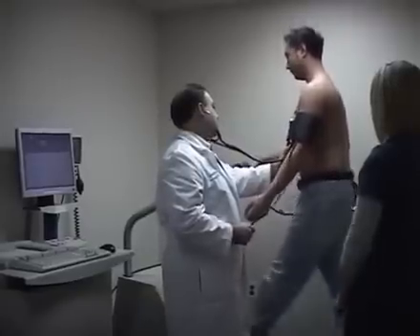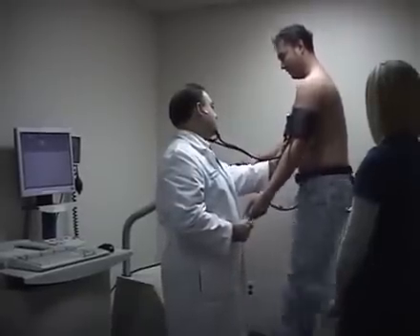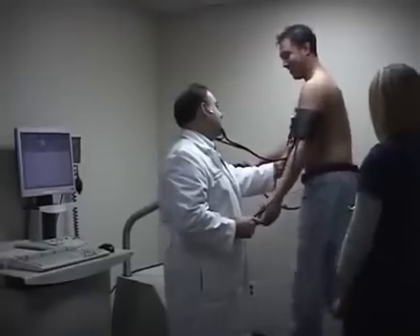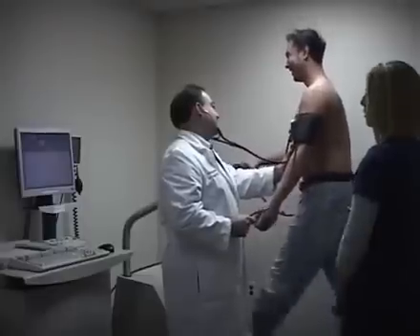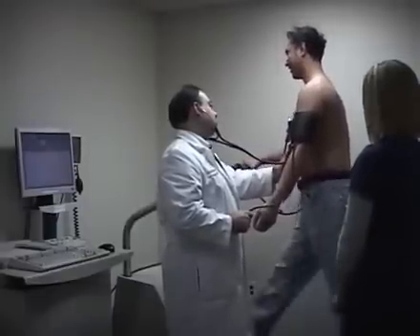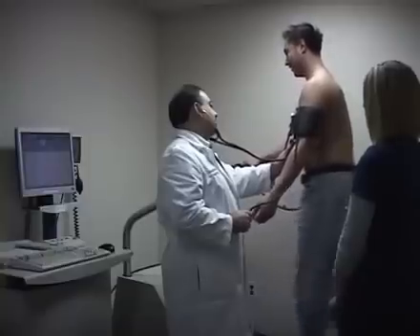This is also a good test to tell us how the blood pressure and cardiovascular system acts during daily activity — while the patient is walking to do grocery shopping or doing other daily activities.